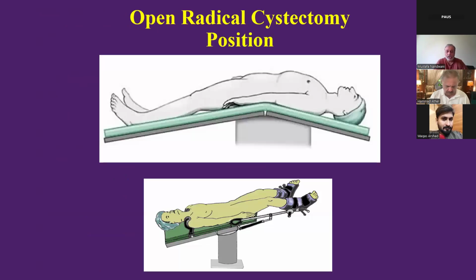So that's the position. What we are talking about, the standard is a supine with break near the umbilicus. That opens up the space between the umbilicus and the symphysis pubis. And below is the Lloyd Davis position.